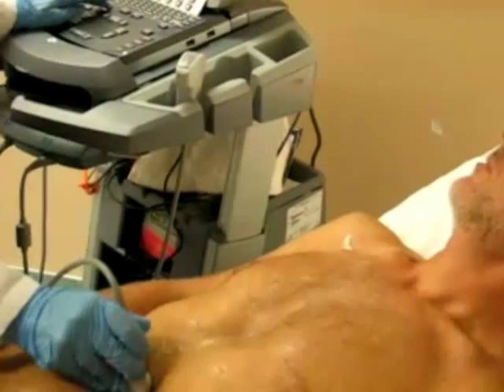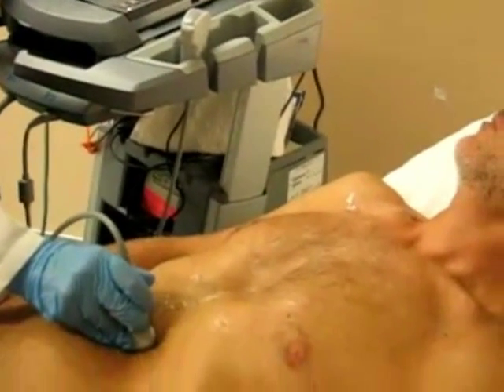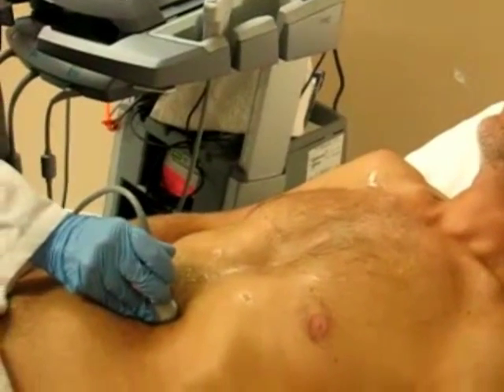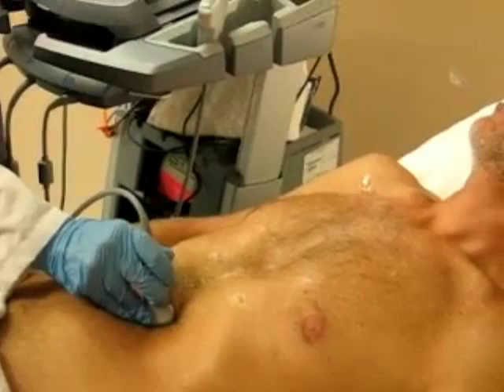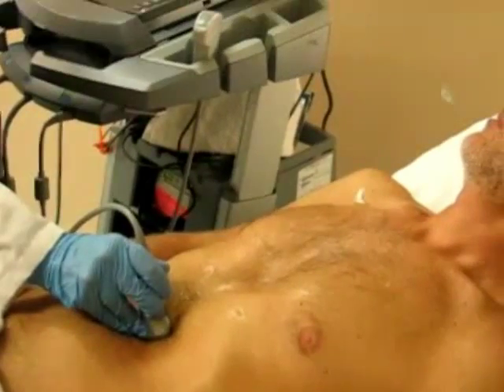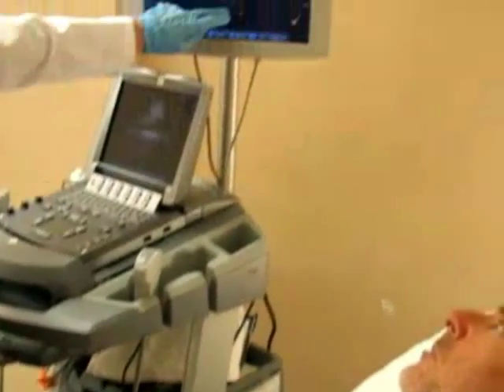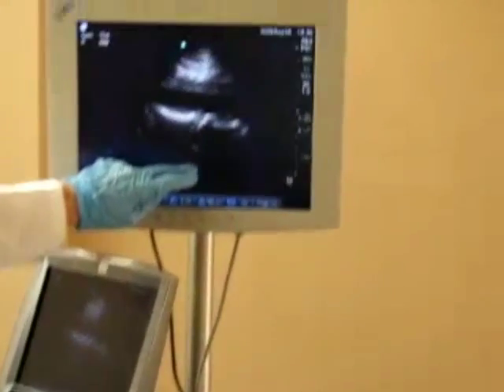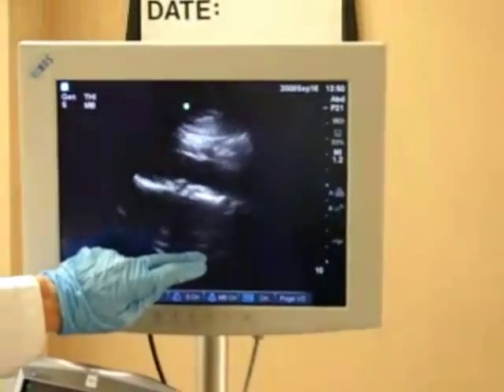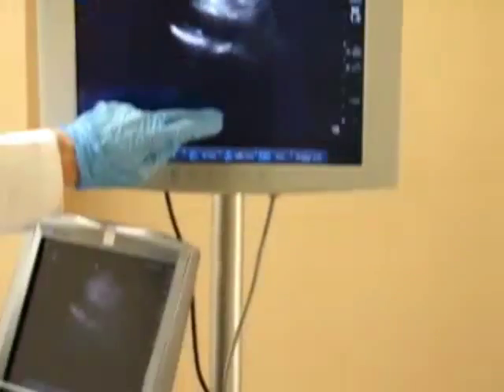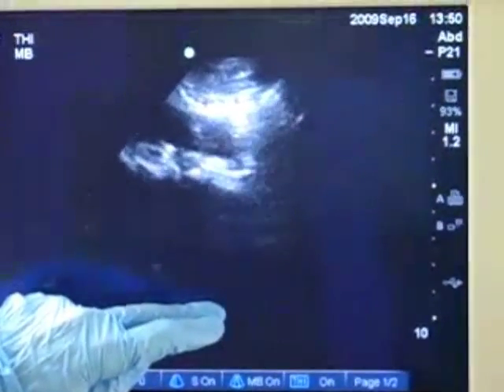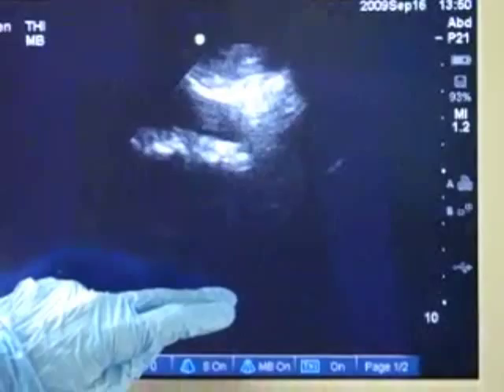In someone who is slim, sometimes you have to decrease the depth in order to not waste the real estate behind it. You work your way down until you get to the bifurcation into the iliacs.